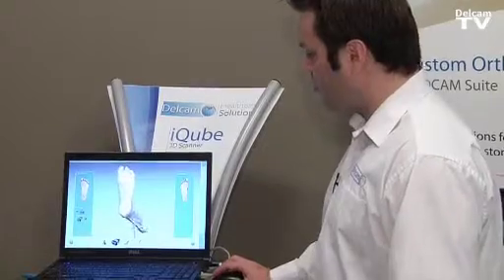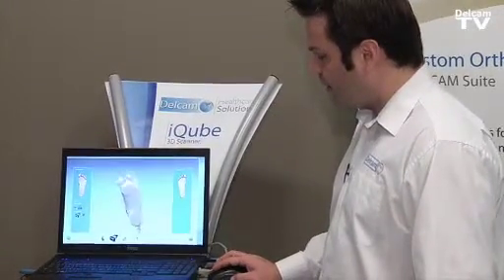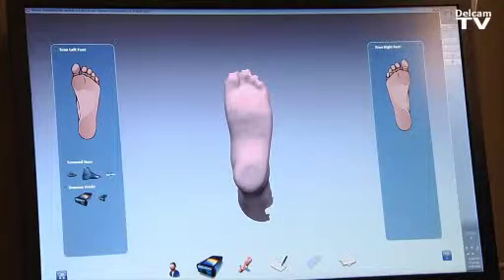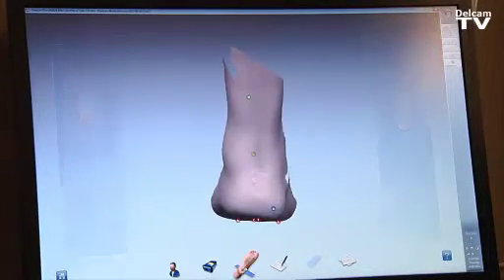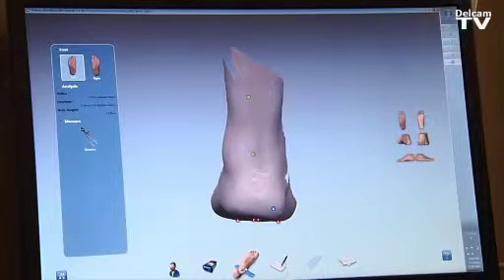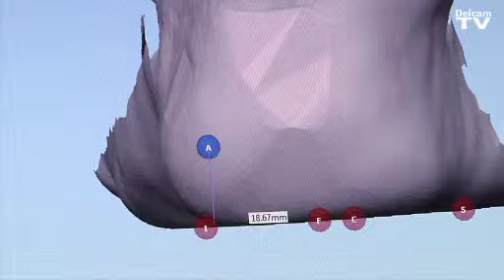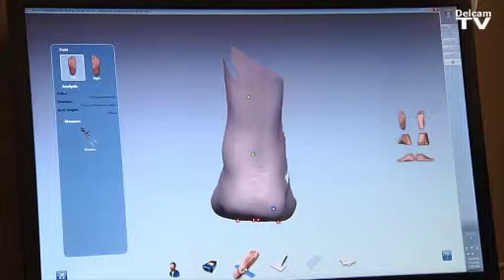Once the software creates the 3D image of the foot, we can evaluate and check it. The doctor or practitioner can click on the next icon to start aligning the foot to the ground and identify the first metatarsal head and the fifth metatarsal head.